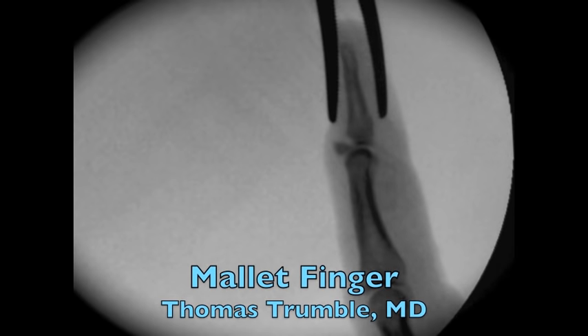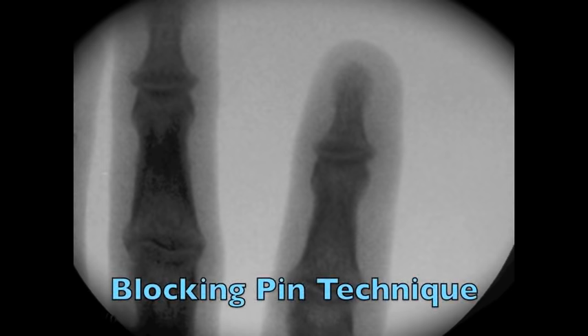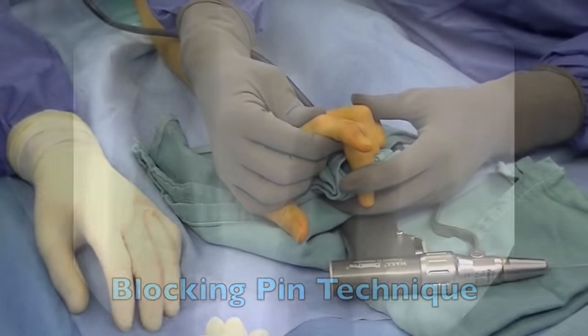Treatment of the bony mallet finger with a blocking pin technique. This is a very efficient technique for the treatment of unstable mallet fingers with an avulsion fracture.